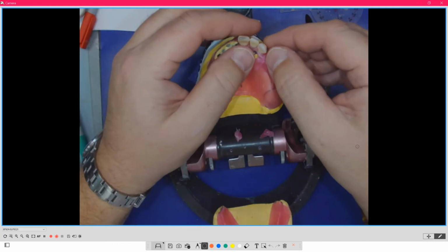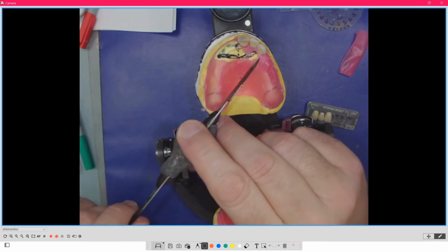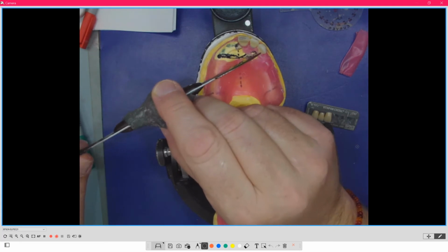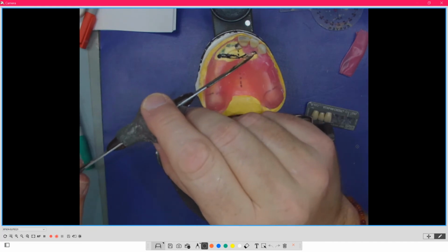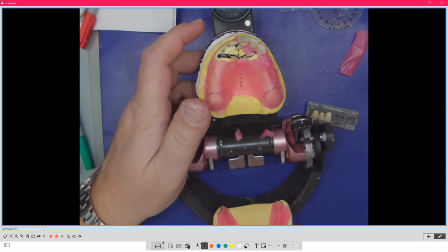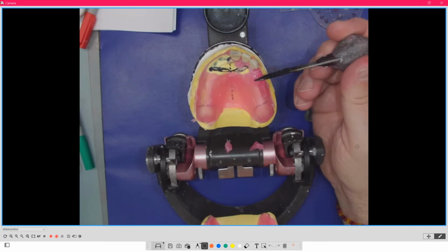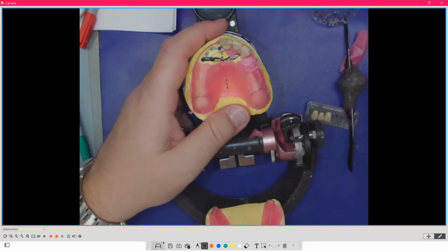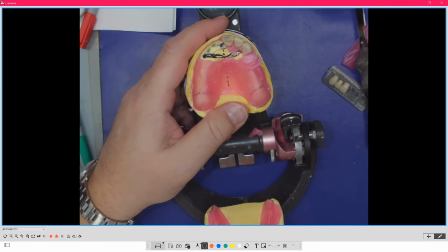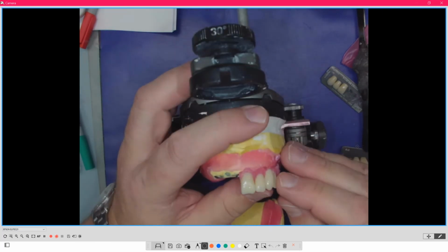Now your tolerance zone is about 1 millimeter, a little bit each way, but this tells me then that as I'm circling through and this rugae is pointing towards this cuspid, that's the right size of teeth at the right arc and angulation, so that this is golden proportioned now for this patient. And that's what's really important, is that golden proportion rule, because remember, everything operates within that golden proportion rule of that patient, which means all the arcs and angles and the function and that chew cycle follows that.